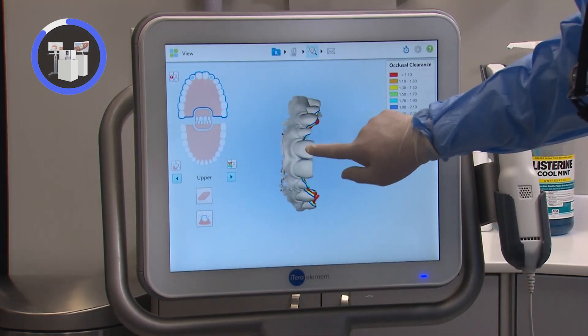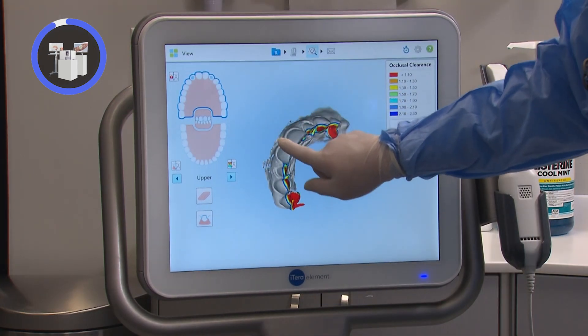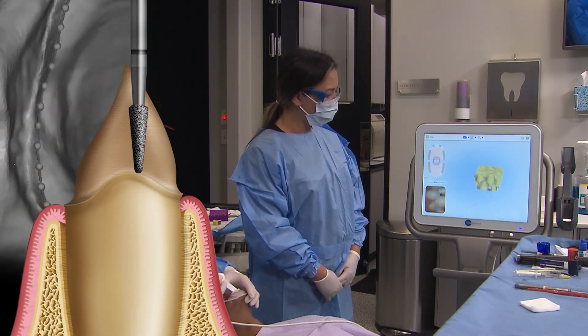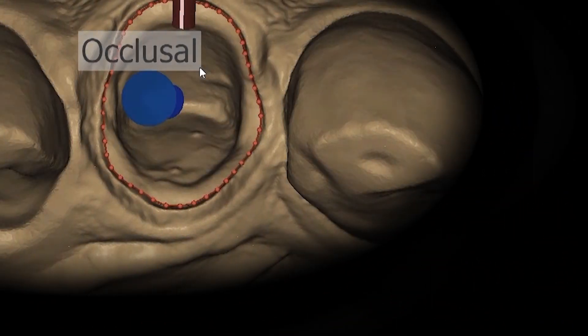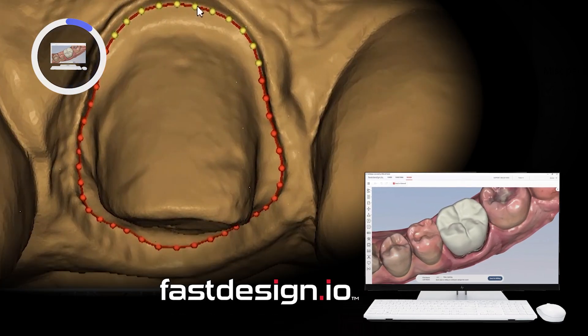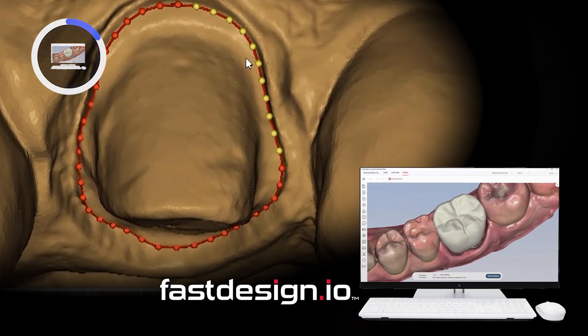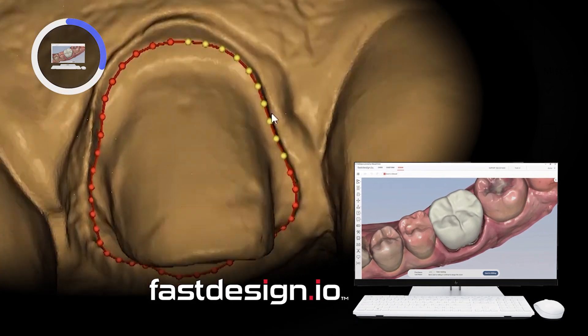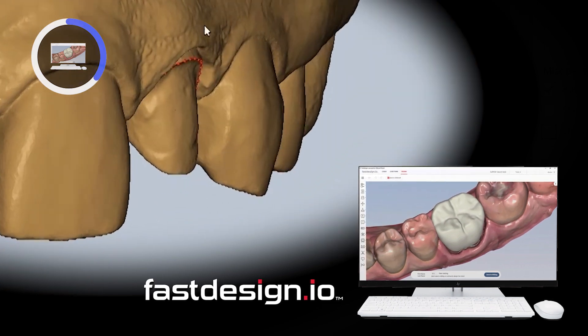Since the final restorations will be Bruxer aesthetic, the digital impression has been transferred to the lab for fabrication. I also transfer the files to our Glidewell in-office system so I can design and mill precise fitting BioTemps Now provisionals. In the Fast Design software, I first mark the margins and define the occlusal and facial directions.